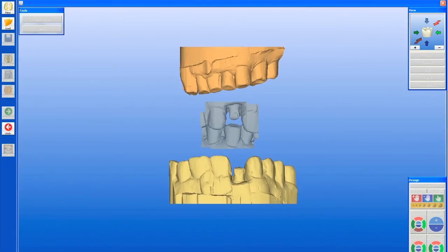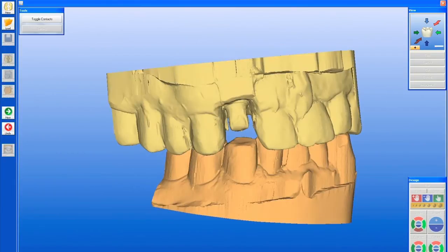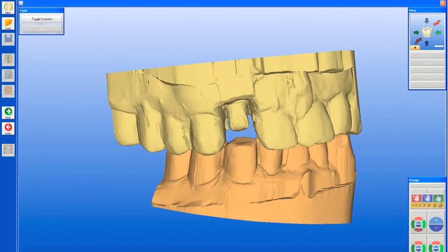Here you can see the upper arch, lower arch, and the bite registration. These are repositioned, and the computer will automatically line up your buccal bite with the preparation arch, and then you line it up with your opposing arch. It basically creates a virtual articulated model, which is fantastic — allowing us to see the complete opposing, not just a bite registration area, giving us a better idea of contours and occlusion.